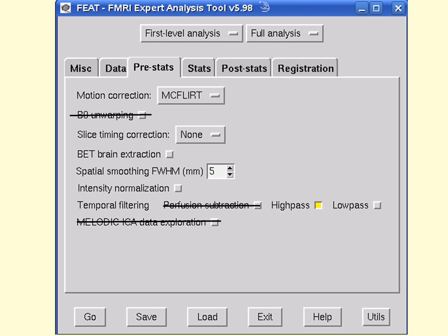So it's something you can do, and you can then subtract the noise components from your raw data as a form of pre-processing, but it's very time consuming. You have to do this by eye almost, so it's not part of the standard pre-processing pipeline, and we won't go into it in any more detail today. If you want, you can try it out on some data in one of the workshops or in your own time.